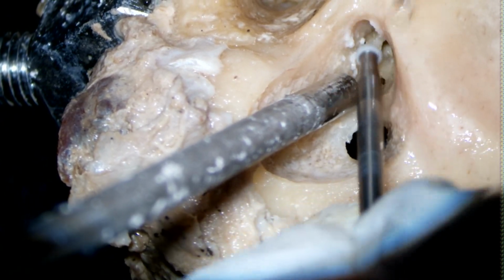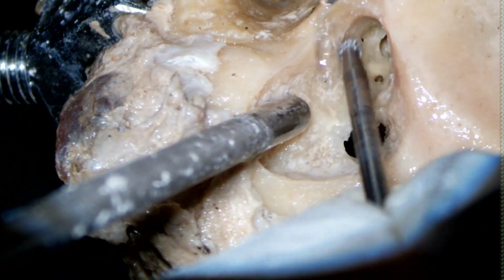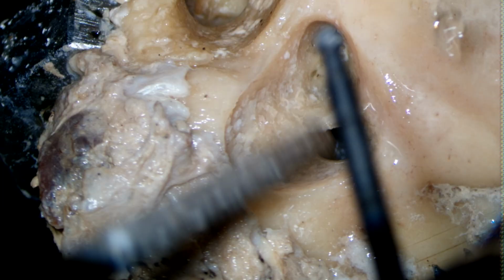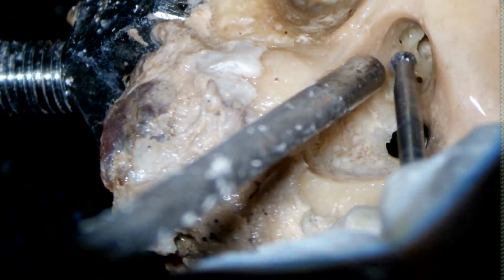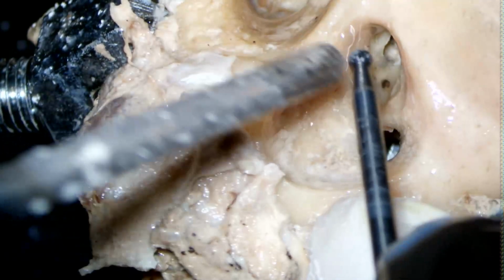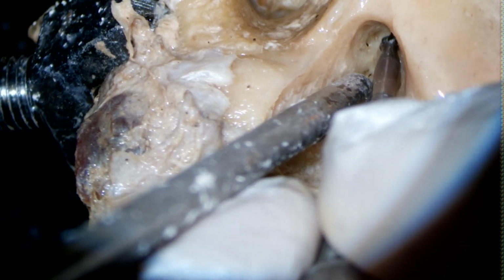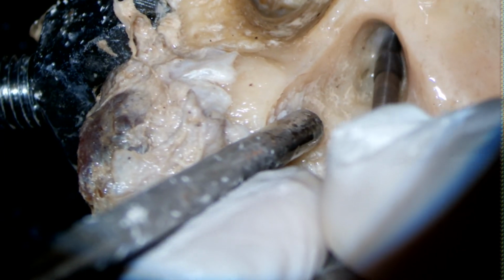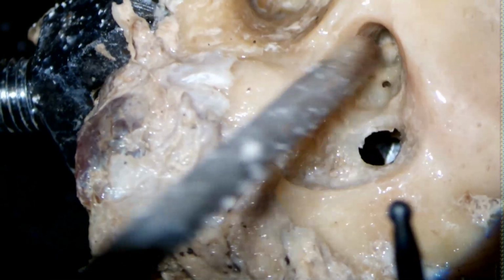Okay, so it is important to use the correct size of burr also when you are doing drilling. A burr is a three-dimensional structure, right? So when you are drilling you should keep in mind all the surfaces of the burr which are actually moving. If you are drilling you might be seeing the superior surface which is cutting, but the under surface might also be touching some important structure and can cause trauma. So it is important to use an adequate size burr for the drilling.